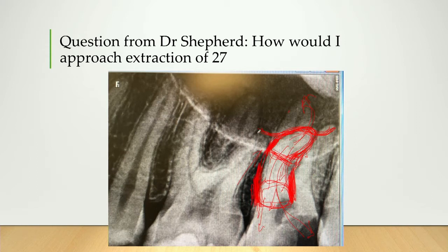Do not push up, because that's when we get into tricky territory, pushing a root tip or fractured root tip up into the sinus area. I'd rather you leave that root tip than make it pop into the sinus, because you can't have an infected root in the sinus. It needs to come out. So then that's a referral, that's a GA, that's the patient going through quite a major surgery to get a little root out for you.